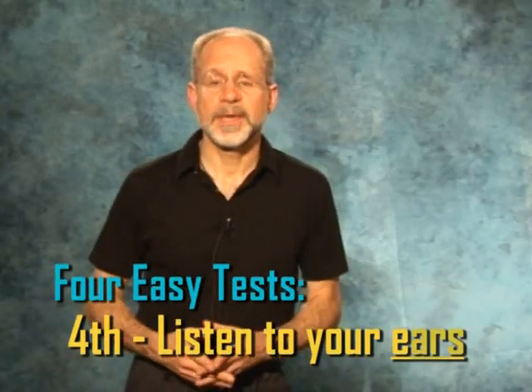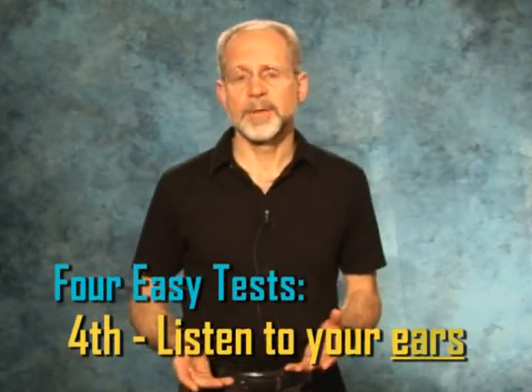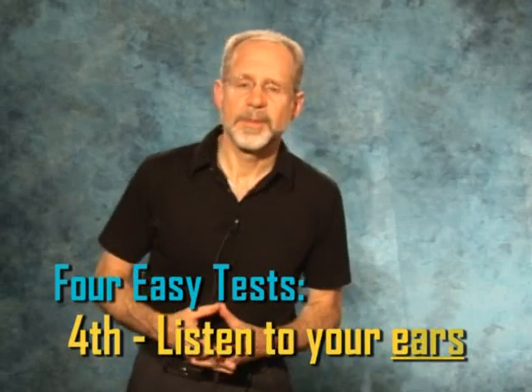The 4th and final test is to listen to your ears. There's a couple of ways you can do this. If you begin by listening in the presence of a steady noise, inserting both earplugs well, you should notice that the sound is balanced between the 2 ears. If one ear is substantially louder, that plug isn't fit as well, and you should try and insert that plug better to get more of a sound balance.